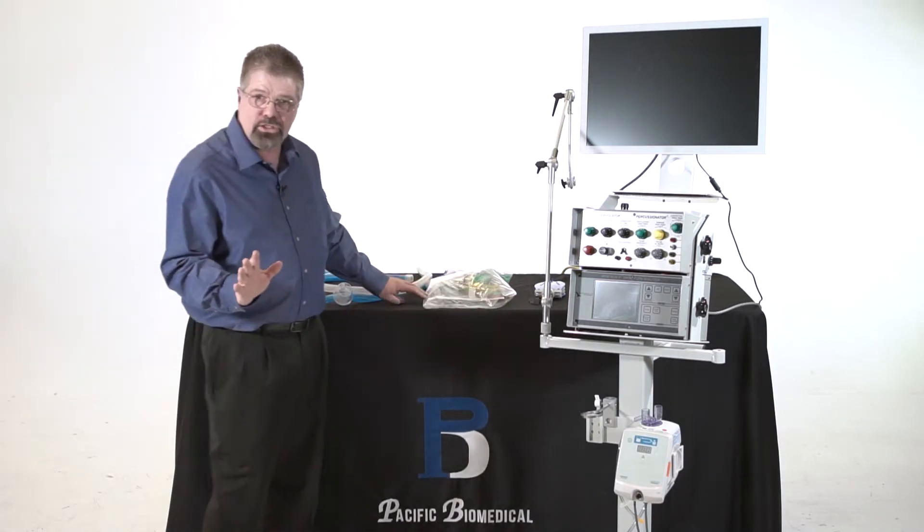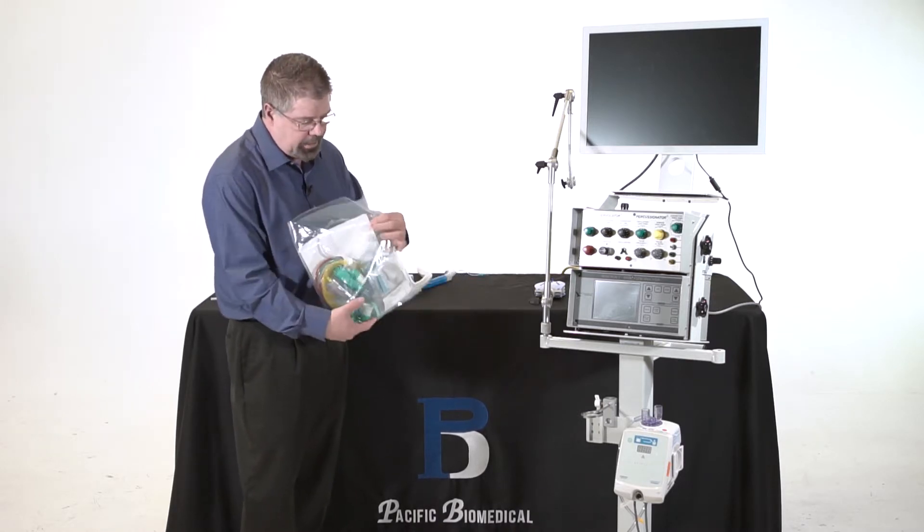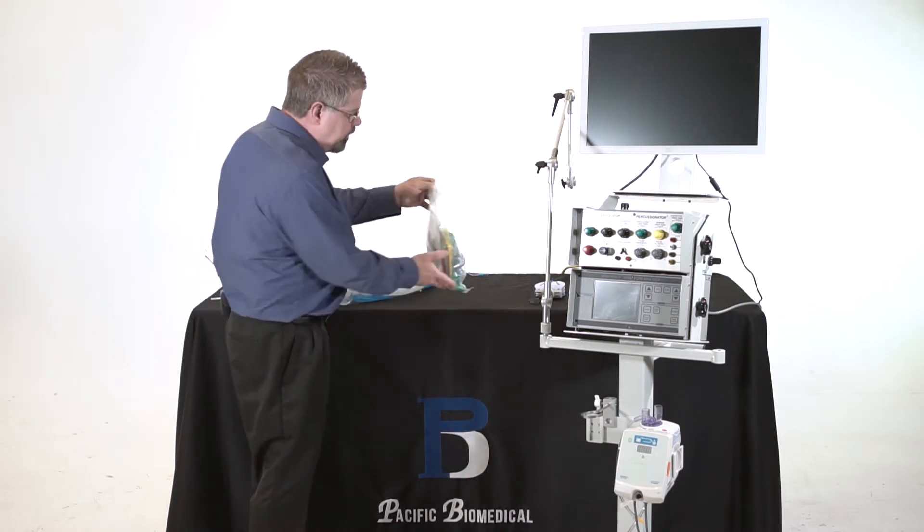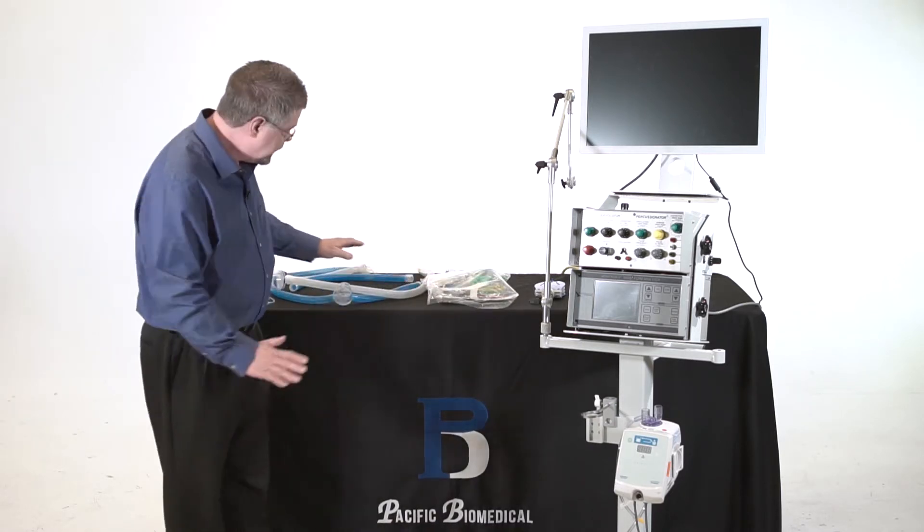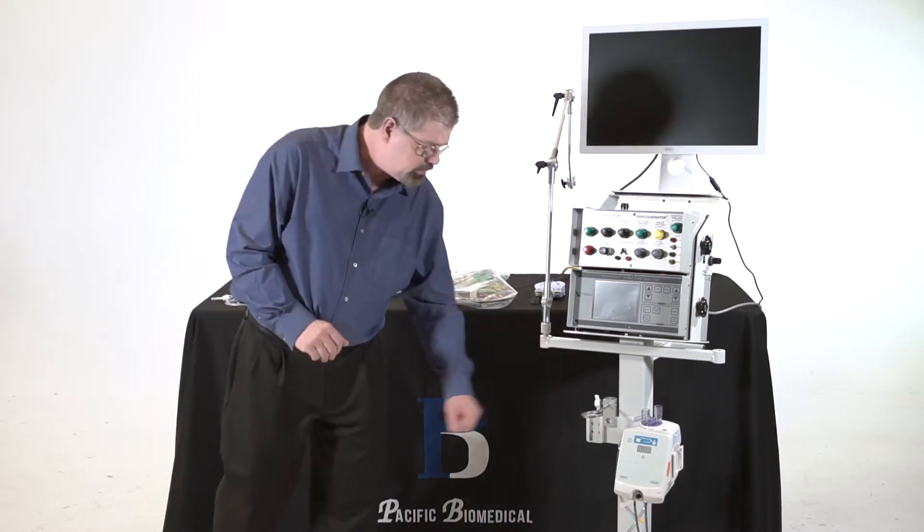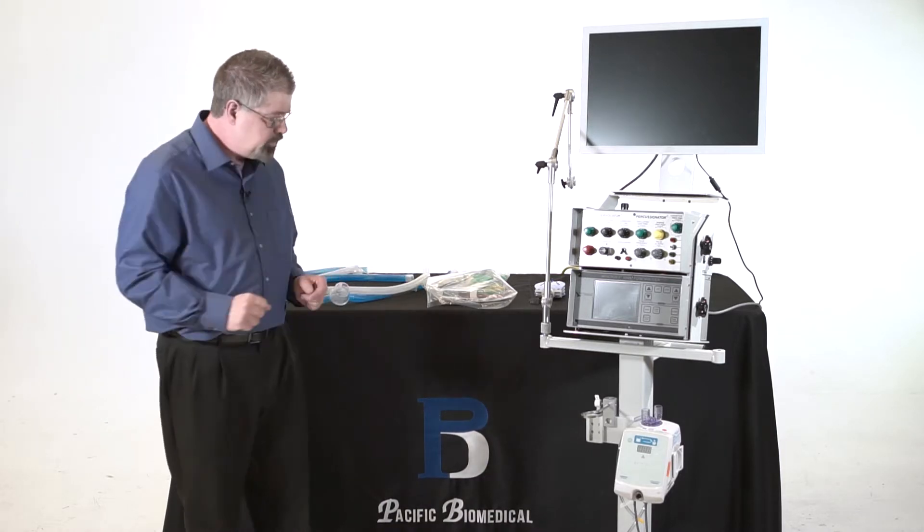What you need for the circuit is Percussion Air sends you a very nice kit that has all the parts that you'll need for that. And then what I'm also going to need to do is I'm going to need to have a standard ventilator circuit to go with it. So whatever your humidifier system that you use, you take your ventilator circuit and marry the two together.